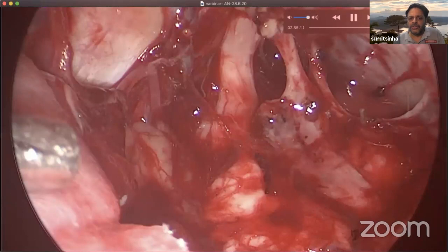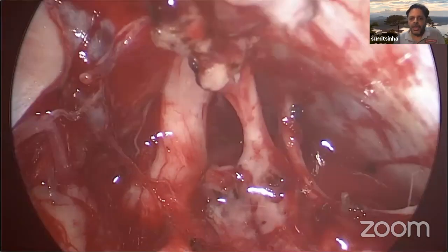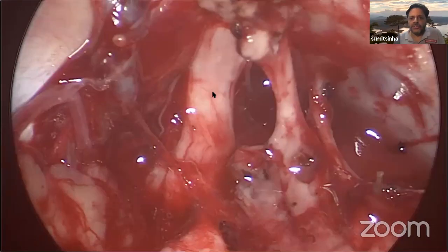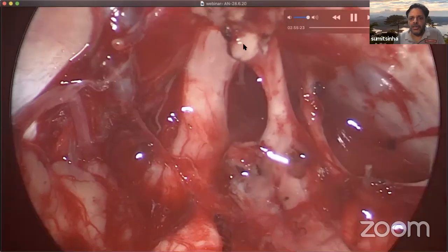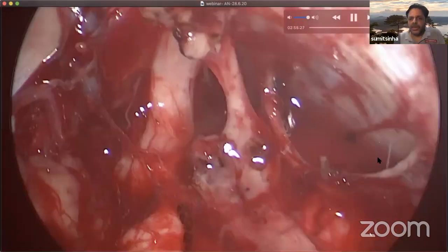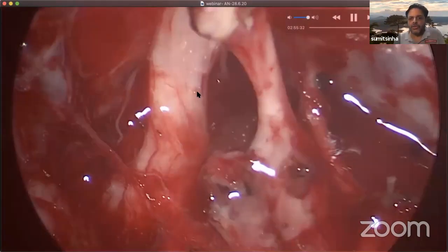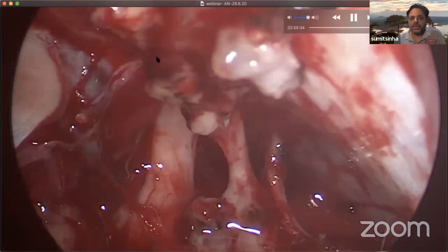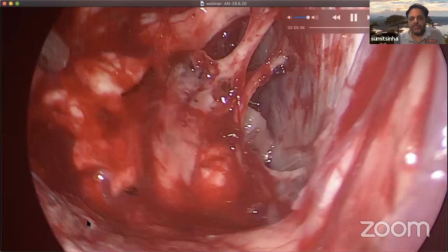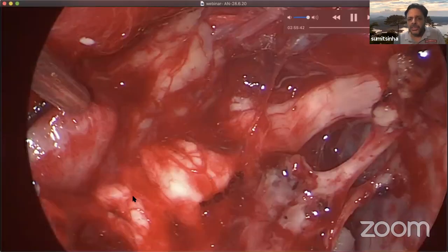You can see the bits of the tumor tissue. You can see the intactness of your neurovascular structures, and some small bits of tumor tissue which are still left. Here you see the trigeminal nerve. In another patient, this is the facial nerve preserved here. This is the sixth nerve over here. And this is the tent, the petrous vein, Dandy's vein over here. And this is a small part of the tumor. This is the brainstem side. This is the cerebellum side, where complete tumor removal has been achieved in this patient also.